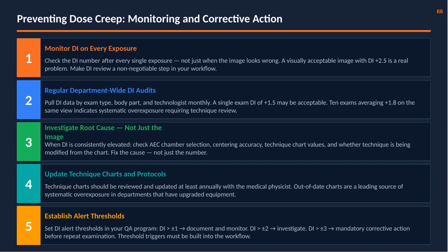4. Update technique charts and protocols annually with a medical physicist. Out-of-date charts are a leading source of systematic overexposure, especially in departments that have upgraded their equipment since the charts were written. And 5. Establish and enforce alert thresholds.